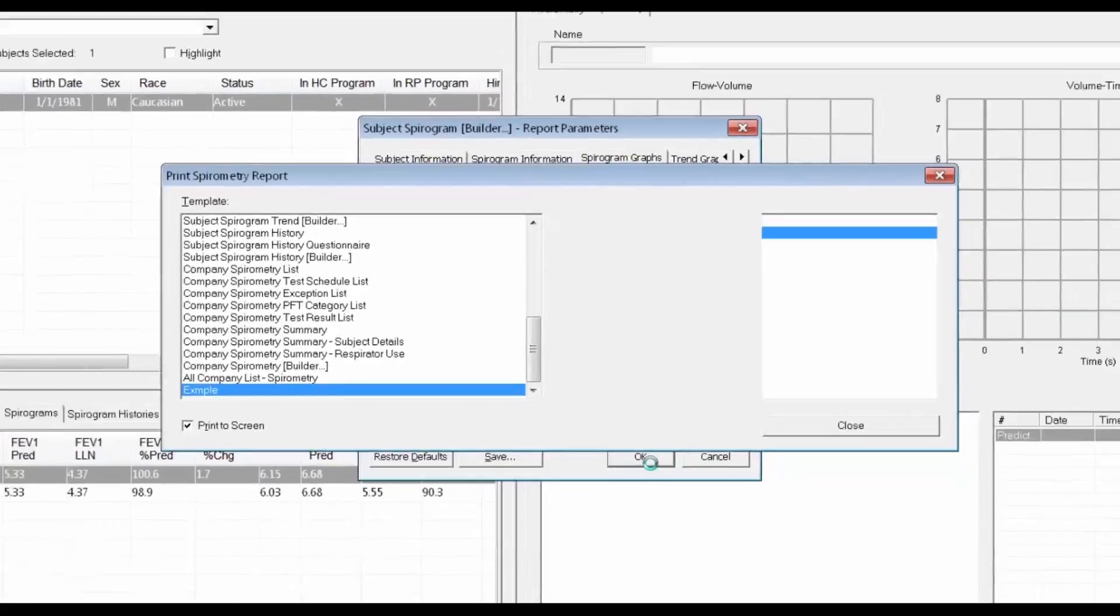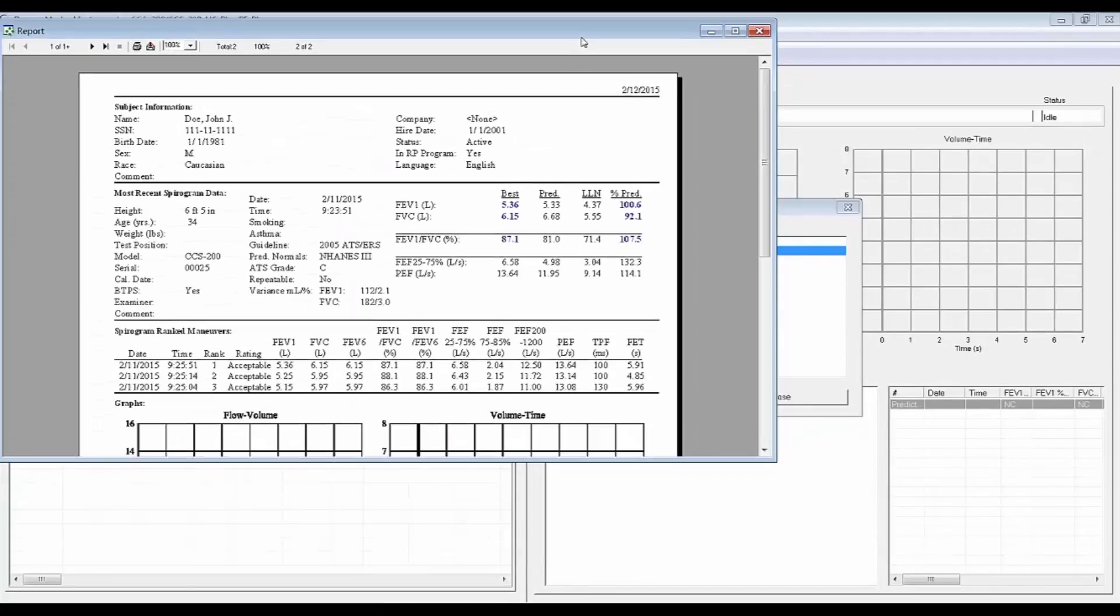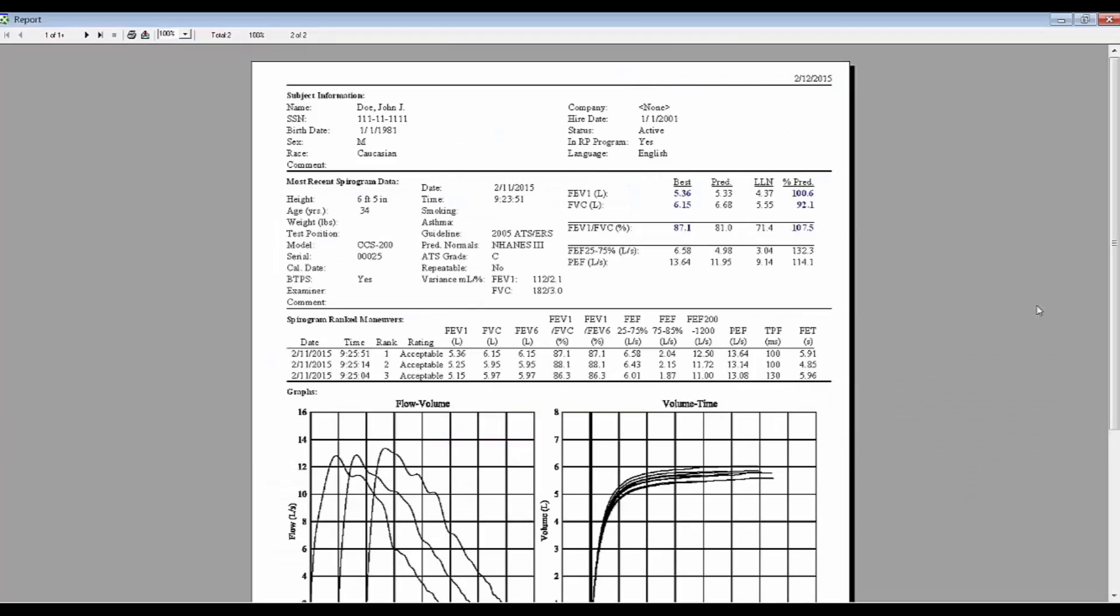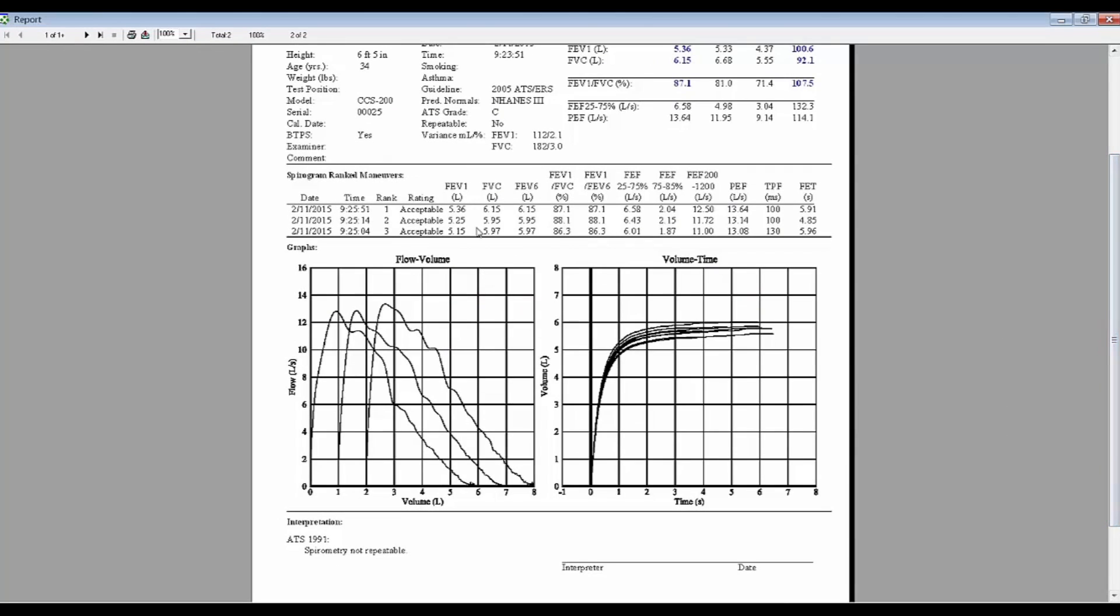Now let's see how the new report works. There's the report that we defined just a minute ago with the sections that we want, and I could add this report to print automatically for each spirogram that I do.